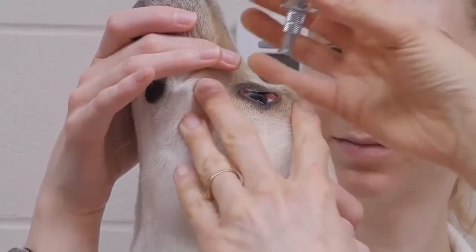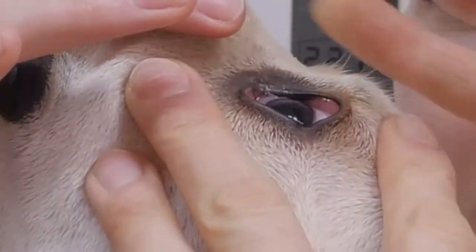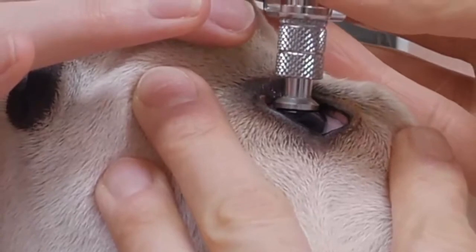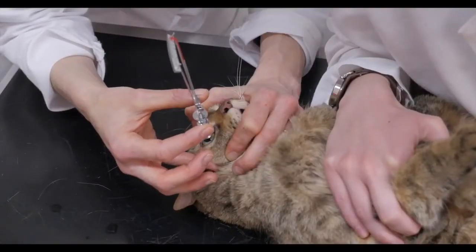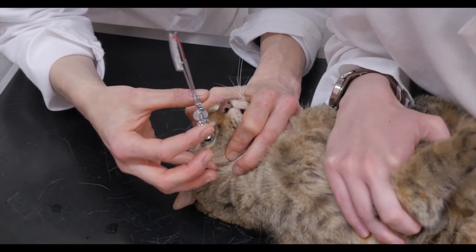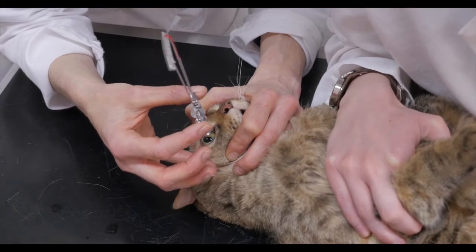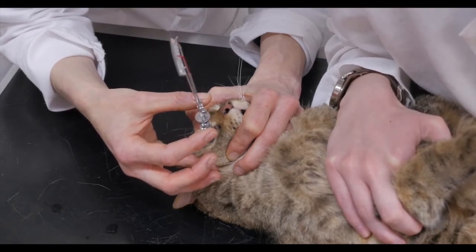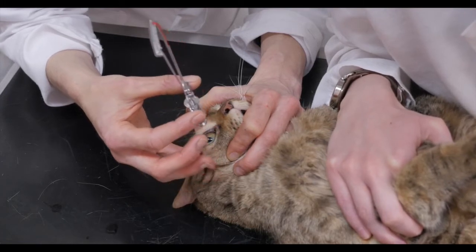The head of a large dog is held nose up to the ceiling by an assistant while the examiner gently holds the eyelids open without placing pressure on the globe. Occasionally in small dogs and cats, it may be easier to place the animal in dorsal recumbency so their nose will point up to the ceiling and their corneas will be in the horizontal plane, allowing the tonometer to be lowered perpendicularly onto the cornea.